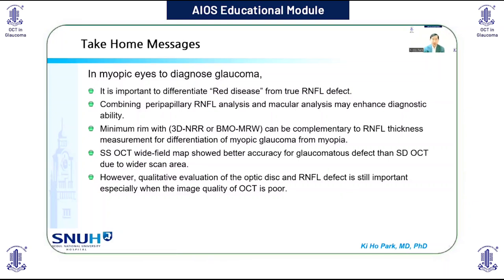However, qualitative evaluation of the optic disc and RNFL defect by photography is still important, especially when the image quality of OCT is poor.